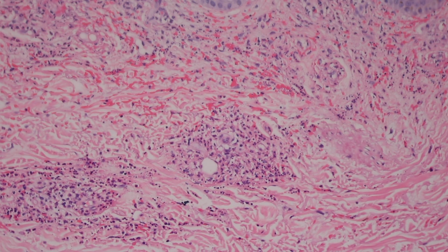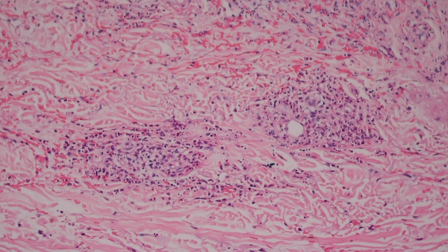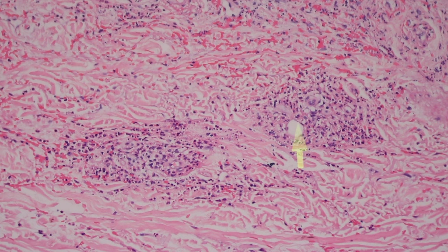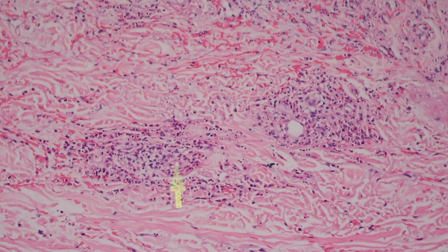When we go closer up, you might wonder, well, where is the vessel? And that's actually kind of problematic in well-developed LCV. The vessel can get so damaged that it's kind of hard to see where it was. But you can see right here a little ring of endothelial cells. So that's the lumen of a vessel. Over here, there's a little lumen of a vessel there with a little red blood cell inside of it.